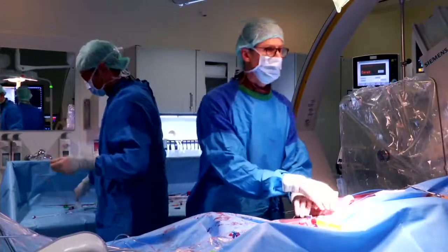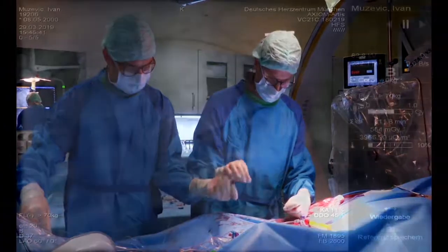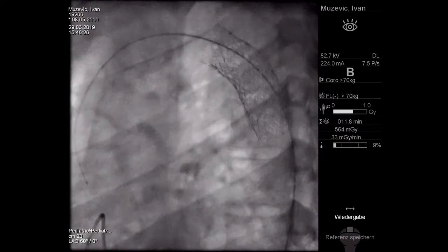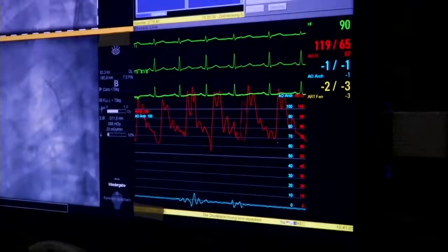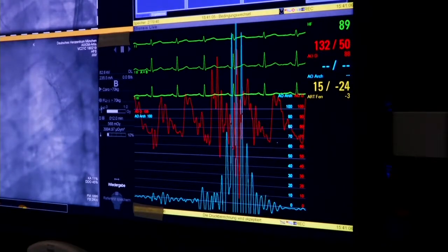Okay, so now hopefully try to give me the pressures. Now you can twist the screen. We have the red line, the descending aorta, and the blue line will be the ascending aorta. We can't see the tracings yet. So please switch to the camera. Is there a gradient? Well, we haven't connected yet. Oh, you have not connected. Okay. Flashing blue, flashing blue.